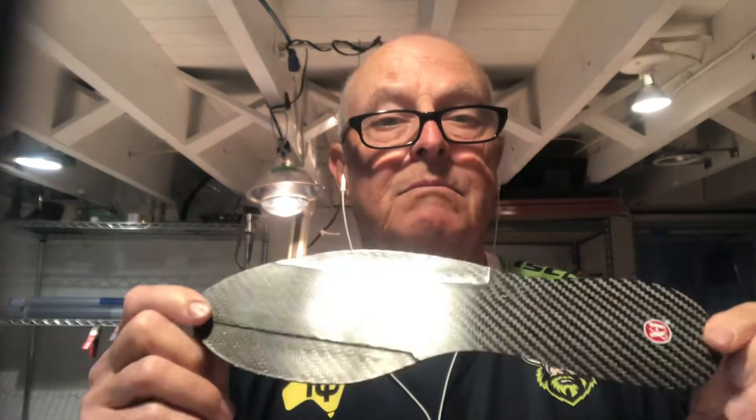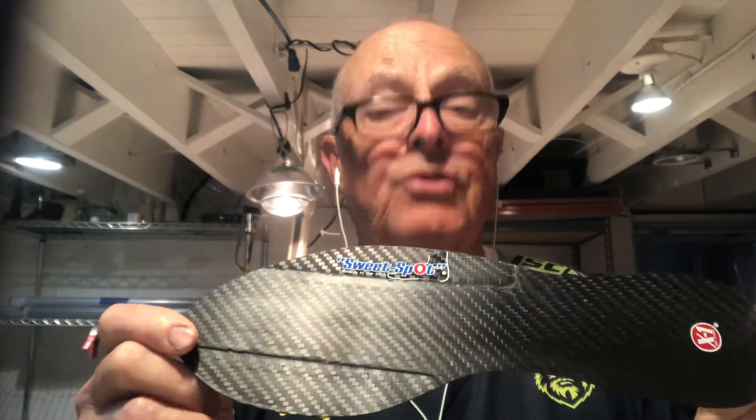Hey everybody, it's Clyde, Clyde's X1 Blades. I've got one of my X1 Blades for 5th Met Fracture going to Leinster Rugby in Dublin, Ireland.